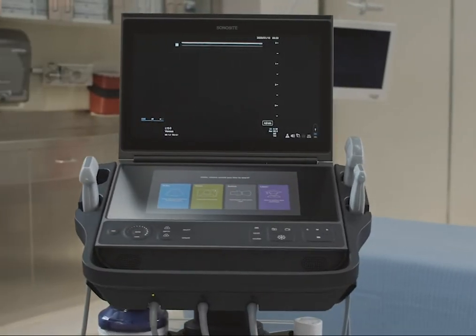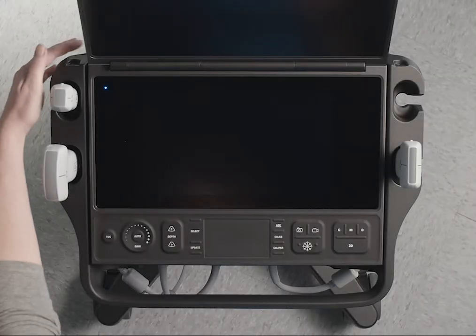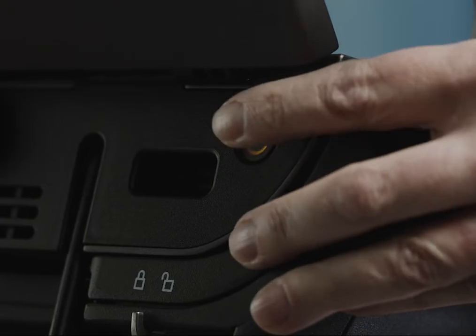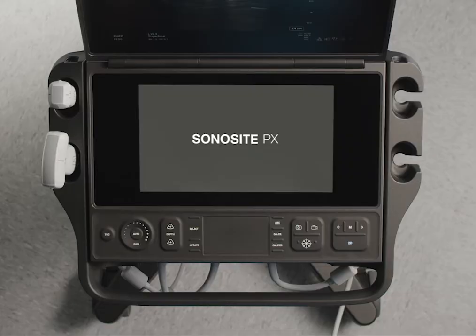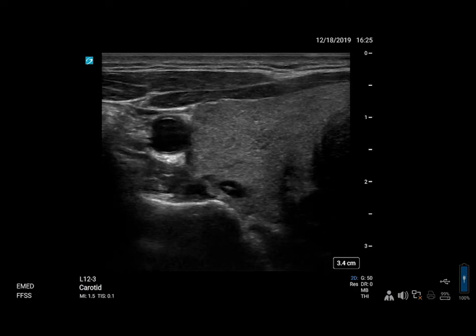Welcome to the Sonosight PX Help video: Performing an Exam. When you turn on the Sonosight PX, it opens in the default 2D Scan mode.